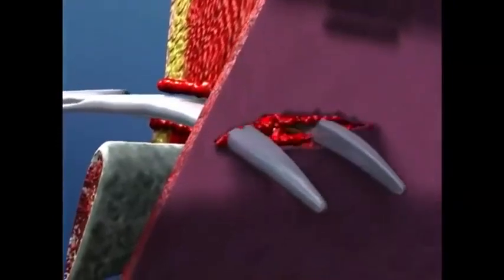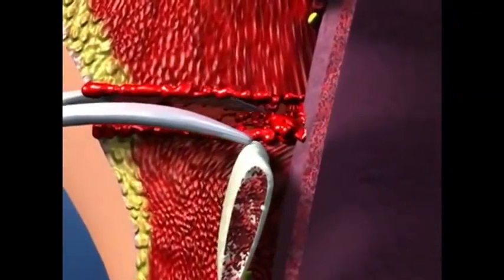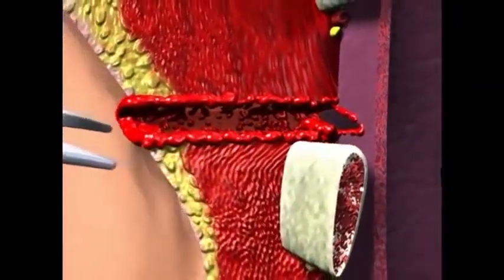Once inside the pleura, spread the hemostat widely and withdraw it while still open to create a sufficient opening in the pleura for the chest tube.